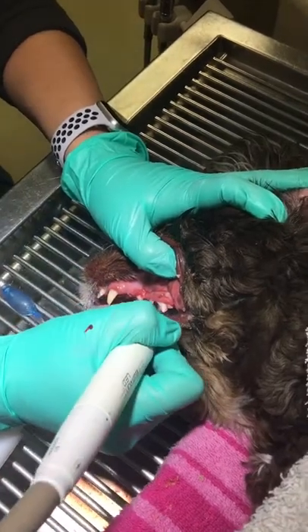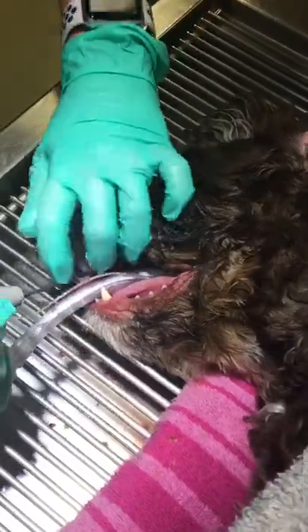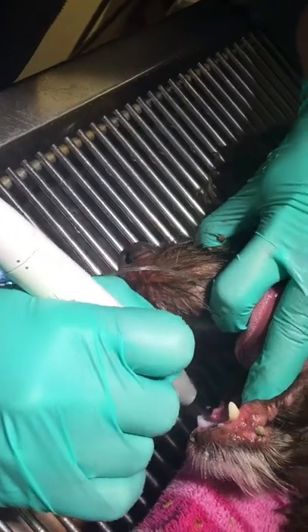Keep scaling no longer than 10 seconds on a single tooth to decrease the chance of damaging the enamel from heat and friction. When scaling, it's important to remember to scale the buccal and lingual sides of the tooth. Gently pull the tongue to the side of the mouth to help visualize.